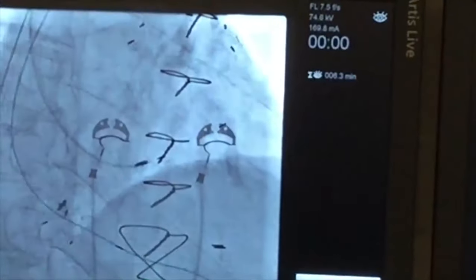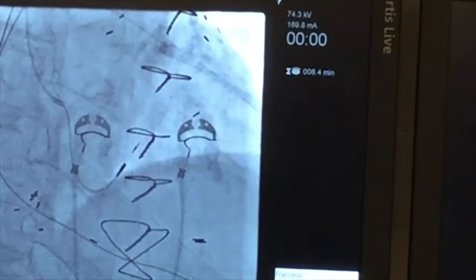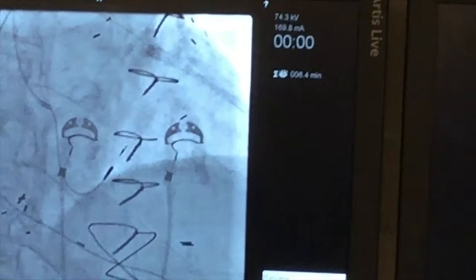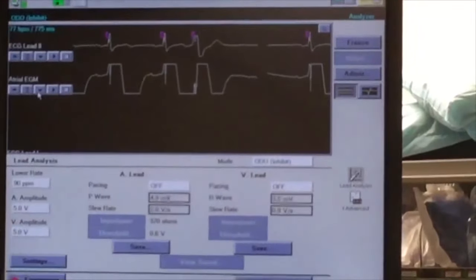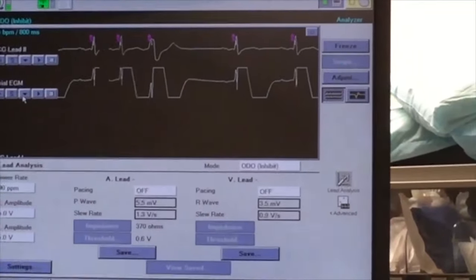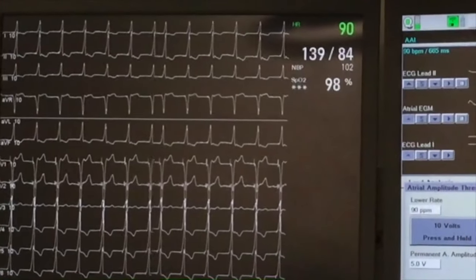This is very similar to parahisian pacing that is performed in the lab, usually to delineate septal accessory pathways. In this case, there's a clear example of VA conduction seen on the 12-lead ECG. On lead 2, which is the second lead from the top, retrograde P waves can be clearly seen. At lower outputs, the VA interval is longer compared to at higher outputs. Here, lead AVR is being pointed out with a retrograde P wave seen at the end of the QRS complex. Once again, lead 2, which is the second lead from the top, shows us the best.